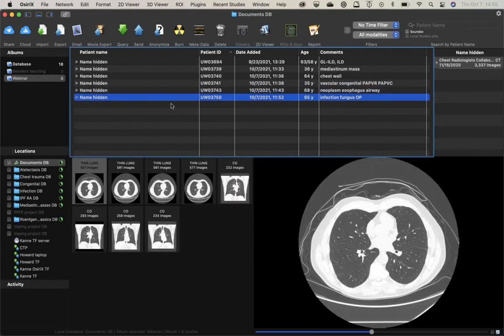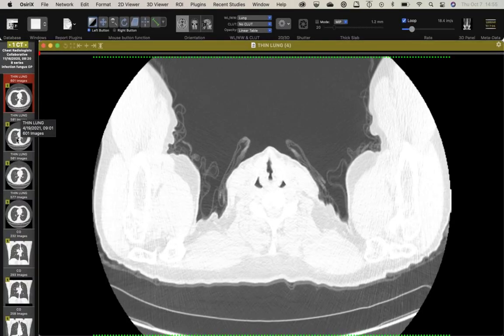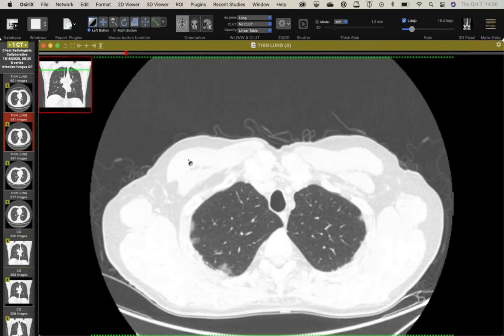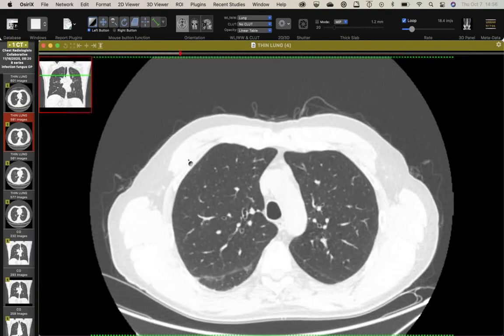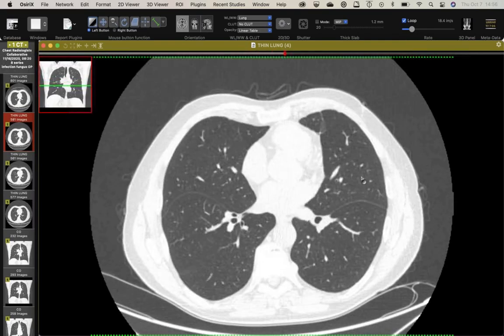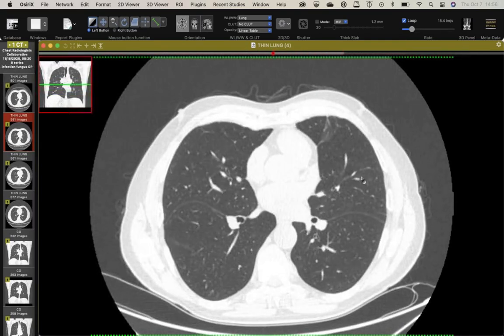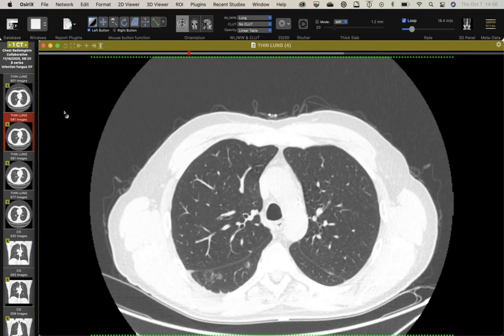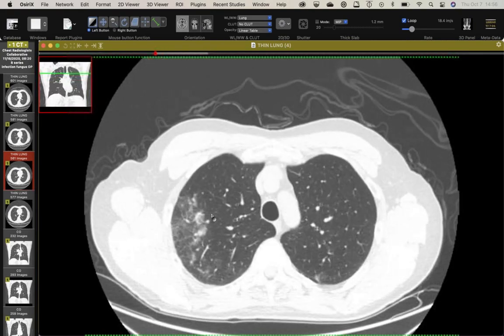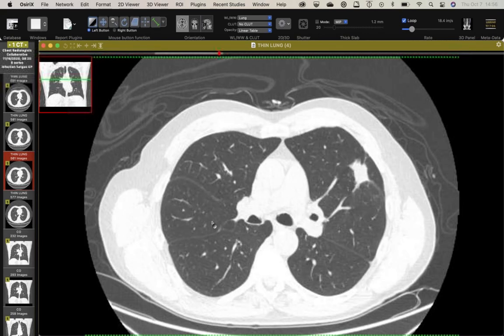This is kind of an interesting case. So this patient, and I never got down and got the order here. This patient, let's see, I want the axials. So this patient had presented with a cough and has a really nice looking organizing pneumonia pattern on CT, and then has this bigger mass here. And so COVID was negative, and so was treated for, I can't remember what they tried to figure out the OP was from, but ended up getting a bunch of serial imaging. So here's the patient a couple months later, and you can see the OP is kind of moving around a little bit there and doing its thing, but this mass kind of just stayed there.